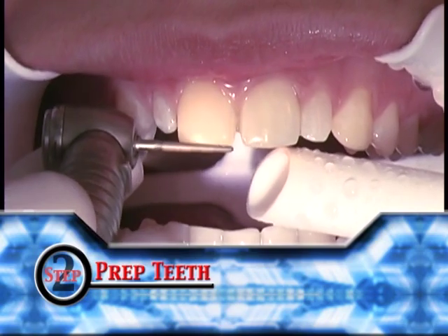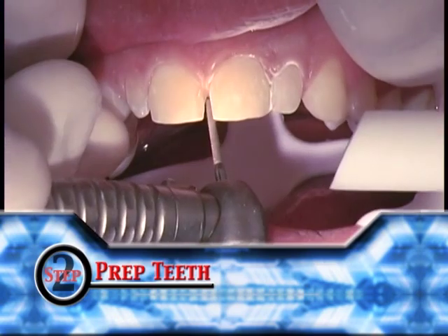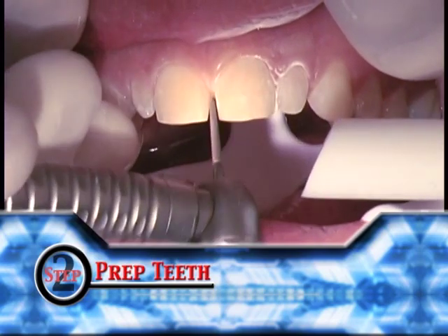The silicone index can be used as a guide to confirm the proper amount of incisal edge has been removed. Remember to widen the space between the teeth enough so sufficient composite can be placed. A thin sliver of the composite simply would not have enough strength.